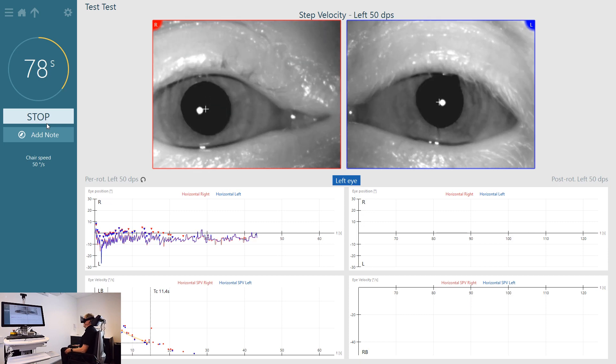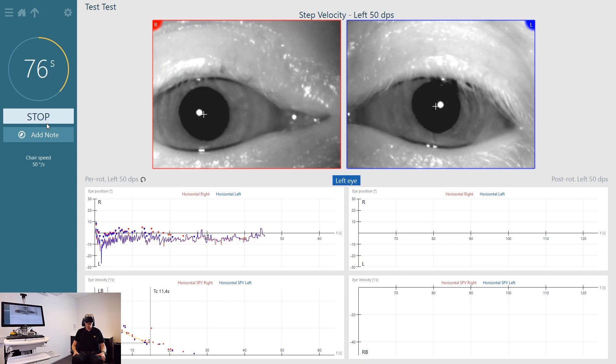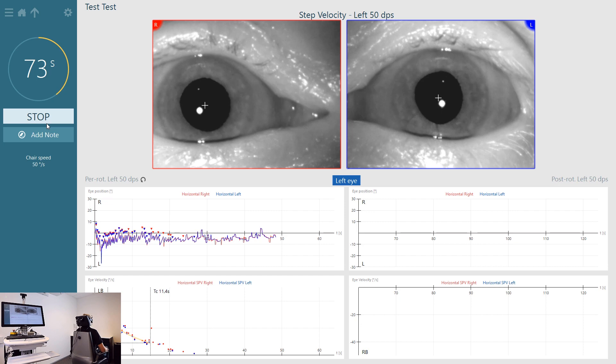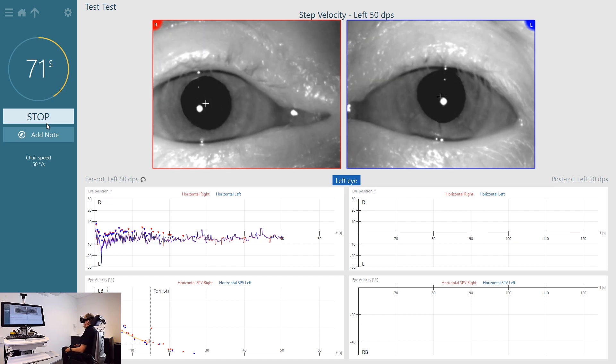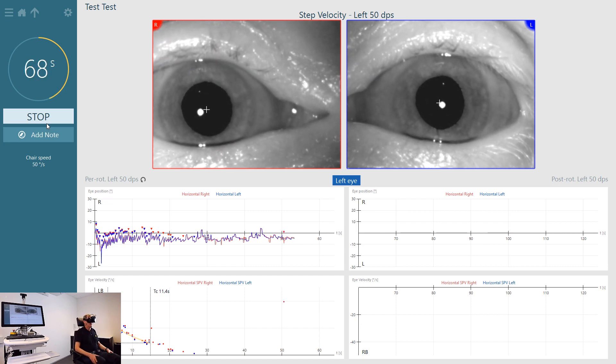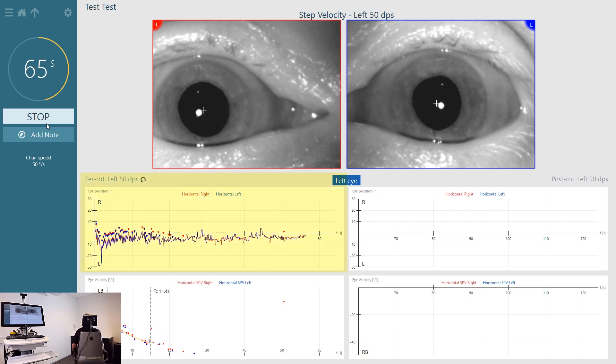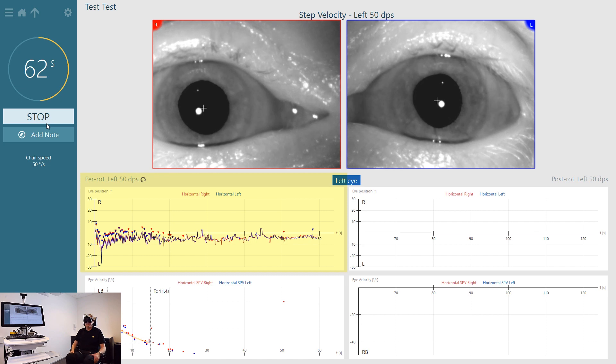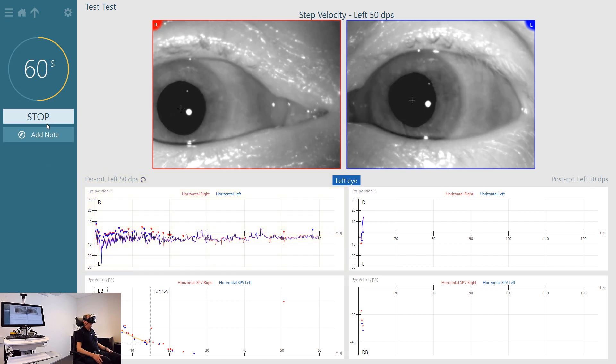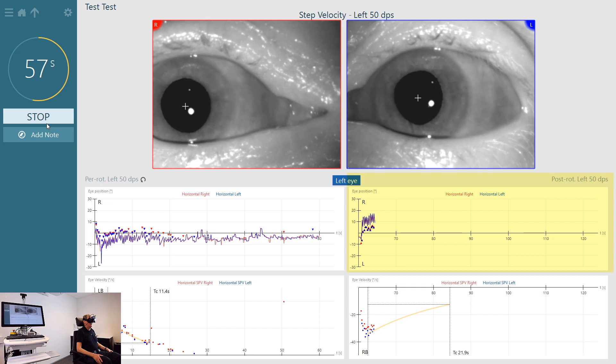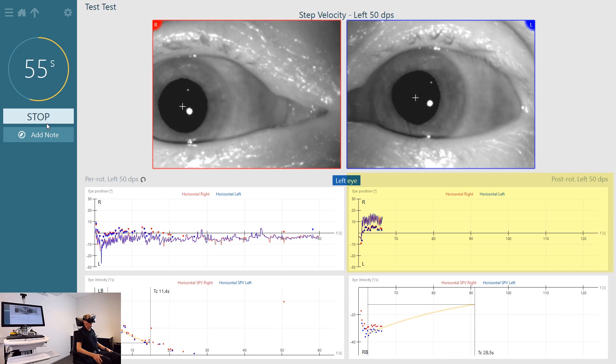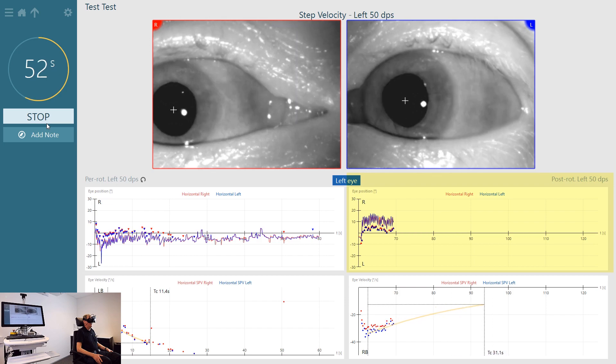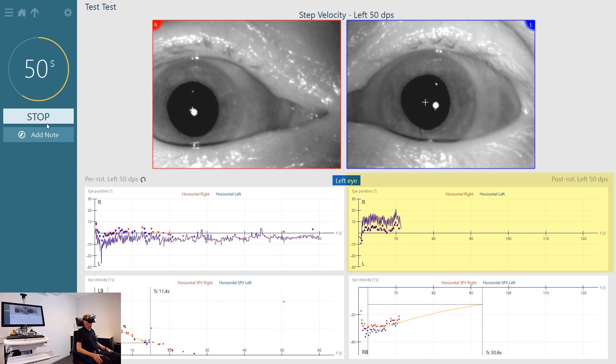Initially up to a slow velocity, in this case 50 degrees per second, and then later up to a fast velocity which will be 180 degrees per second. The first 60 seconds are known as per rotation or during the rotation, and then the patient will stop and we begin the post rotation portion of the test. You can see the nystagmus is significant as soon as the patient stops.